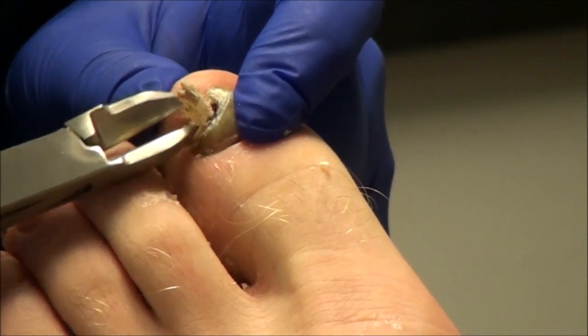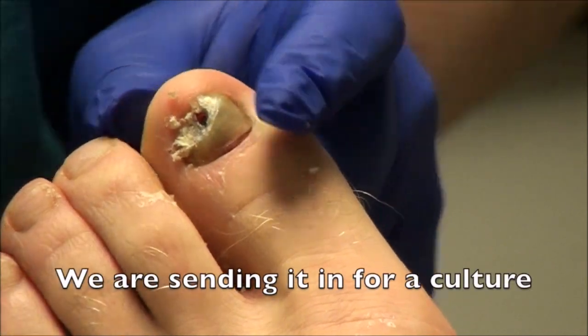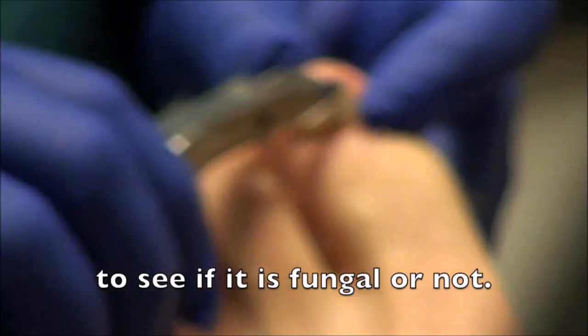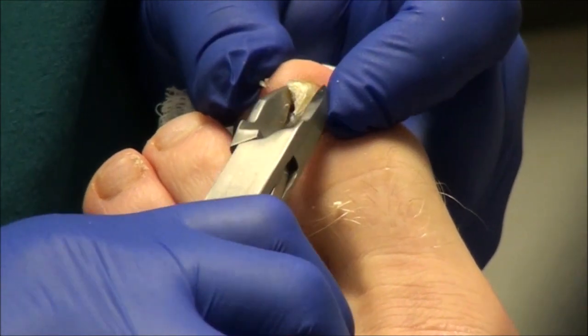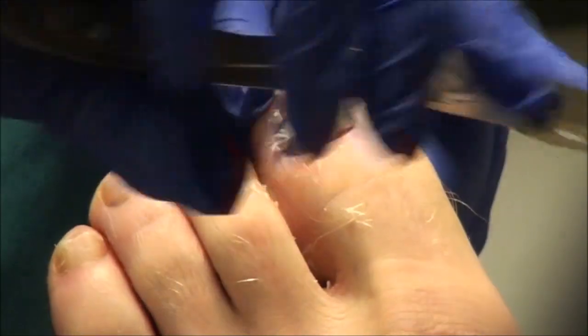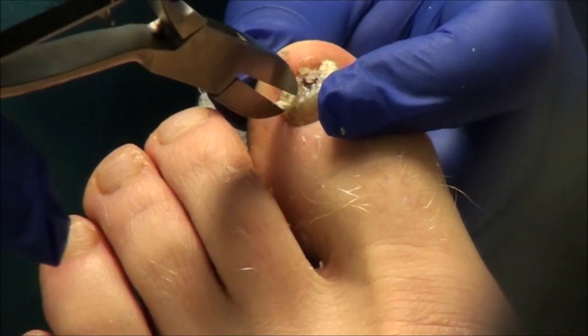So we're going to take this piece with some of this debris from underneath and send this piece in. You have some of the nail lifted up off of here, just from the bruising under the nail. So that's part of it, but the nail is definitely thicker over on this side.